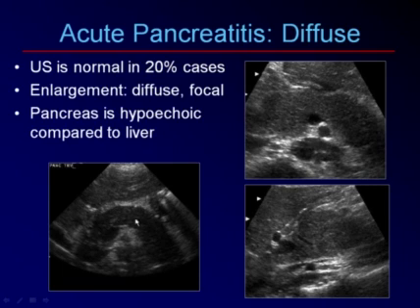But we have to be careful when, let's say, it's a subacute situation, because sometimes the liver is fatty, which makes it more hyperechoic, which could make the pancreas look hypoechoic. So we have to watch this relationship and see which of the organs is abnormal. Is it the liver that's too hyperechoic, which makes this look hypo, or is this truly acute pancreatitis hypoechoic, and this is just a normal liver?